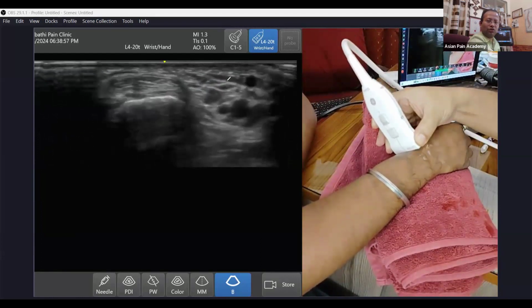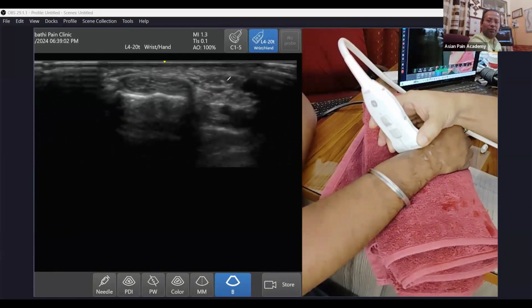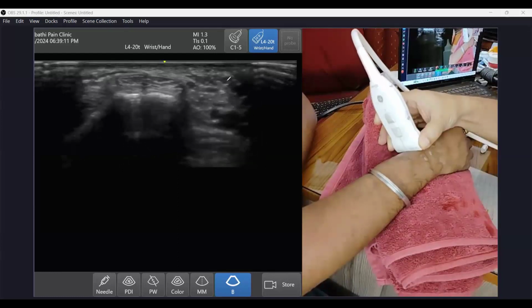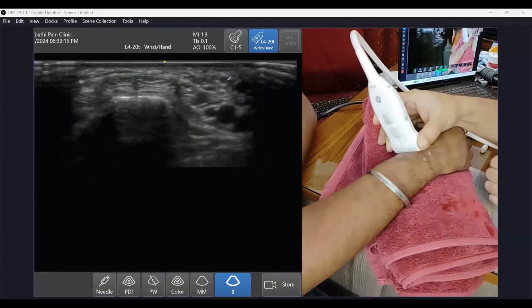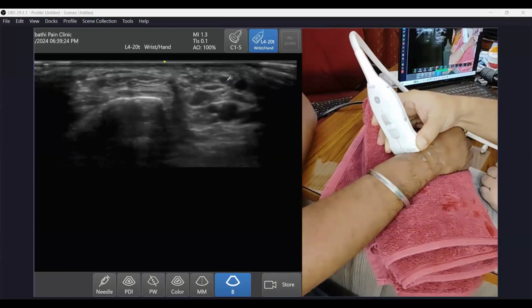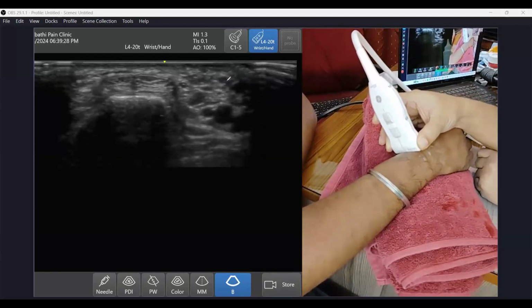I am holding the probe in the short axis. I think she's wanting to know how you have oriented your aspect marker. Is that what you want to know? Yes, and the movement, like one overlapping, is not clear if we are seeing how the probe is moving on the wrist simultaneously. You want to know whether I am moving proximally or distally or side to side?